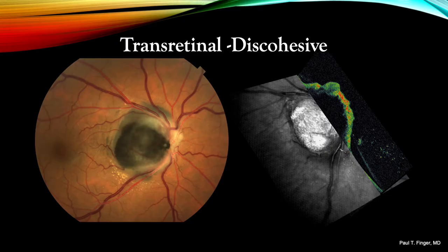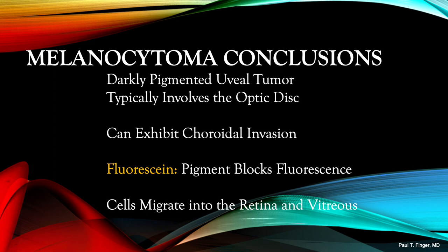Here we have a very interesting case. This patient requested enucleation for a symptomatic growing melanocytoma — he did not want a biopsy and wanted the eye removed. A clinical correlation between optical coherence tomography, histopathology, and color photography showed that the tumor was growing into the adjacent choroid, while clumps of melanocytoma were found transiting through the overlying retina and extending into the vitreous. In conclusion, the darkly pigmented melanocytoma typically involves the optic disc, can cause disc edema, and its cells can migrate through the overlying retina into the vitreous. Fluorescein angiography is blocked by the pigment, but an edematous optic nerve will hyperfluoresce.